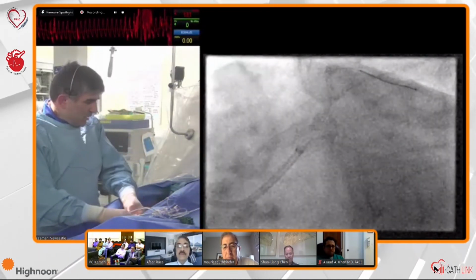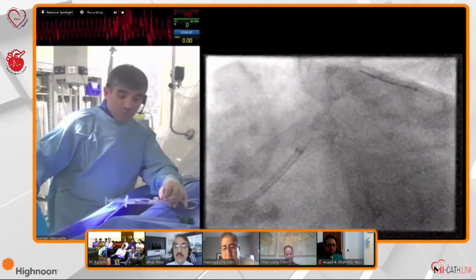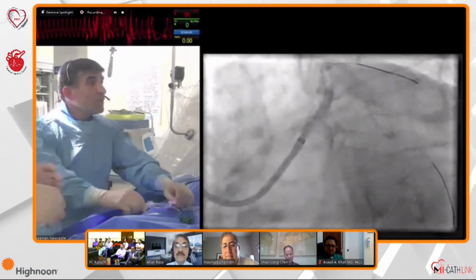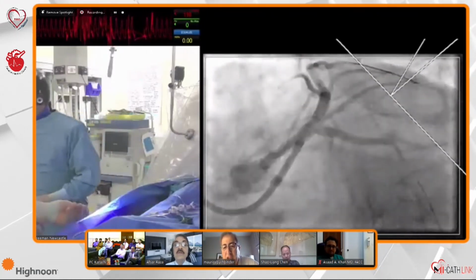Yes, okay. So I'll post-dilate quickly to the LAD. I'm going to take a picture here to show you what we've got. And we could IVUS it also. Look at that. Angiographically, I wouldn't ask for any more. Exactly. There's no need to go much higher with the 5.5.